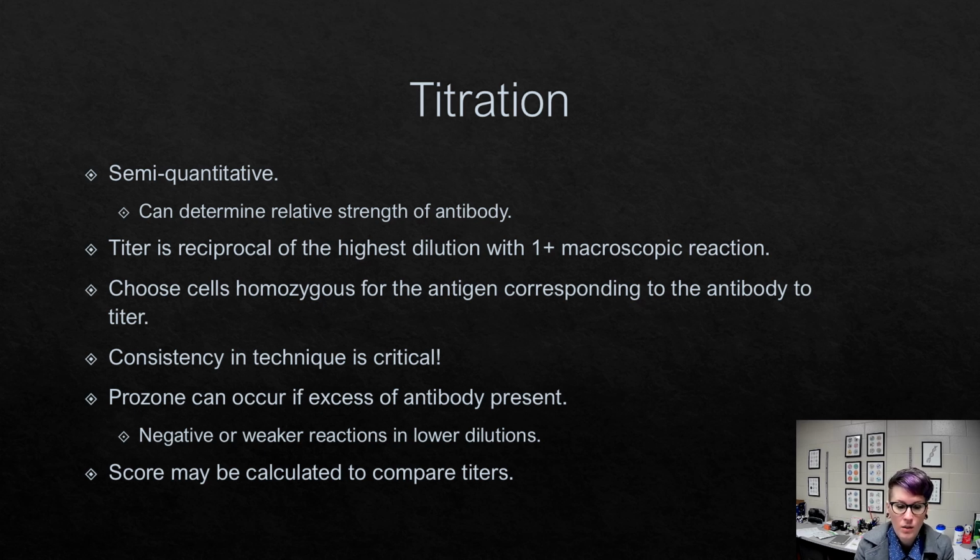Consistency is very important between techs. At this level, different techs have different reading methods. So it's very important that everyone is reading that 1+ reaction at the same level.